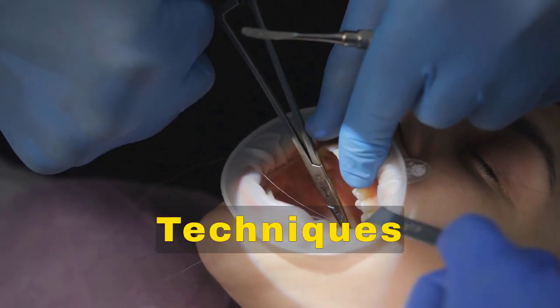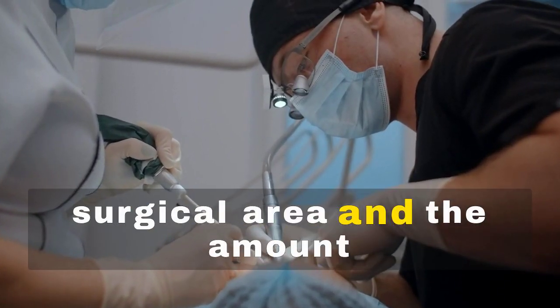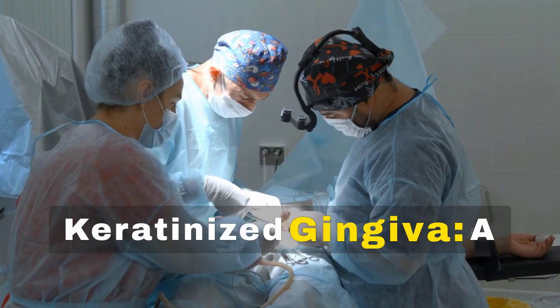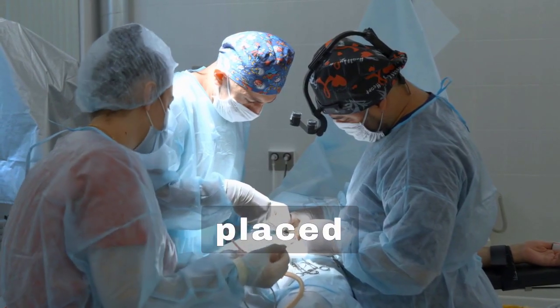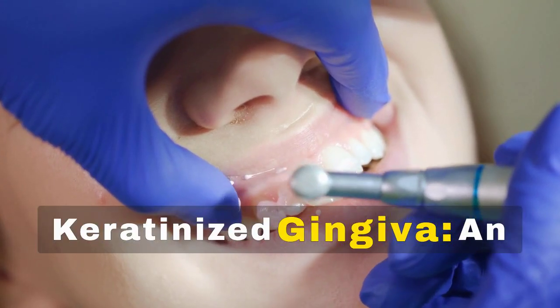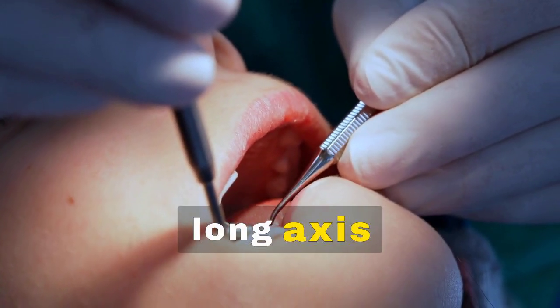Gingival incision techniques. Incision methods vary based on the surgical area and the amount of keratinized tissue. With minimal keratinized gingiva, a submarginal incision is placed 0.5 to 1 millimeter from the gum edge. With adequate keratinized gingiva, an external bevel incision is made at a 45-degree angle to the tooth's long axis.